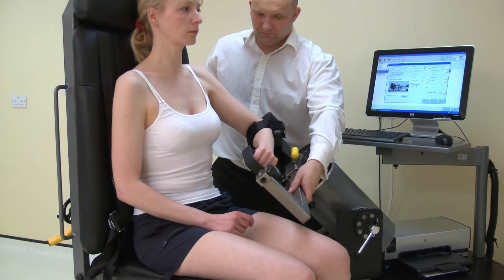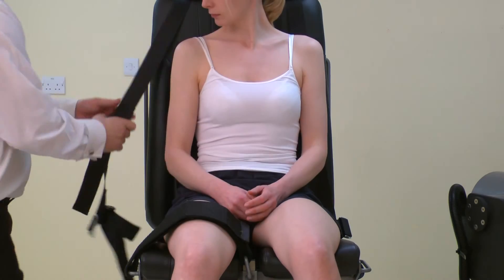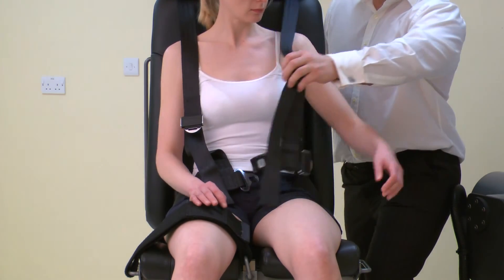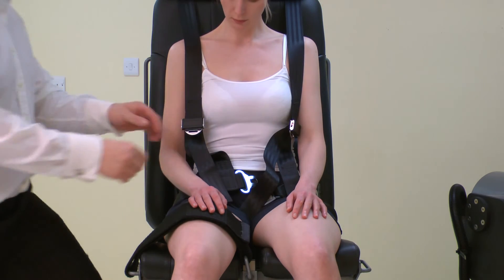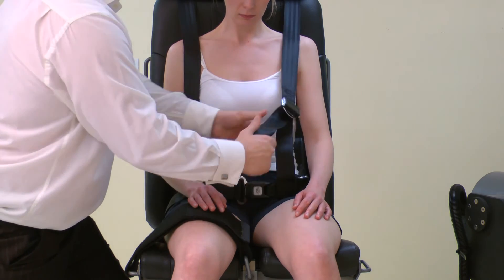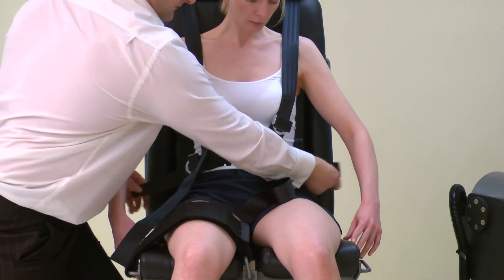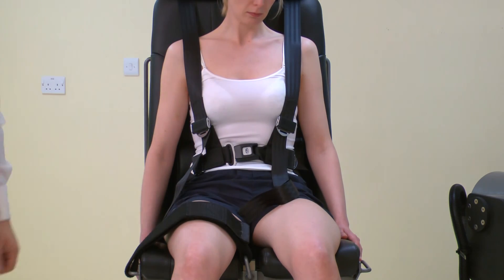Now check the axis of rotation. Finally, attach the shoulder straps if required. To use the chest straps, first place both arms through the loops. Then clip the straps together using the clasp. Tighten the upper straps until the waist sections are above belt level. Now tighten the waist straps keeping the clasp centrally on the waist.